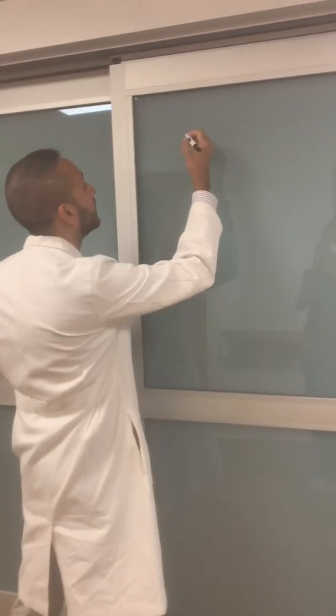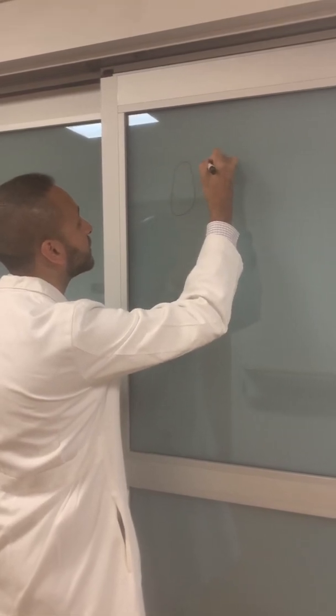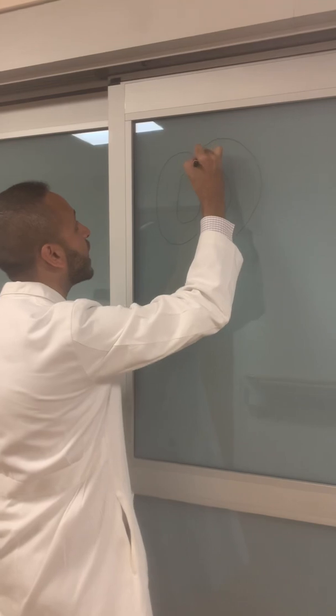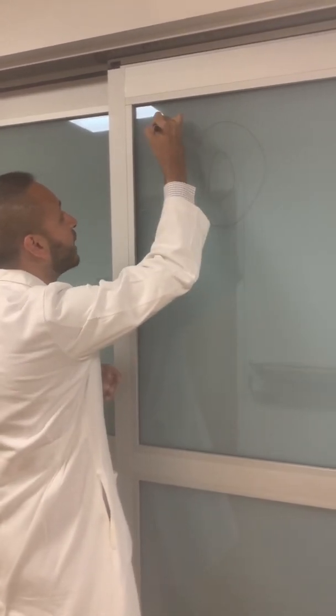We're gonna do a few minutes on ICP, right? So let's go over the ICP waveform. I'm gonna give you a crude look at a brain. If you think about the brain, these are the lateral ventricles, the EVD is coming in this way.